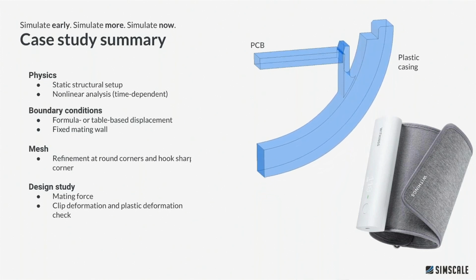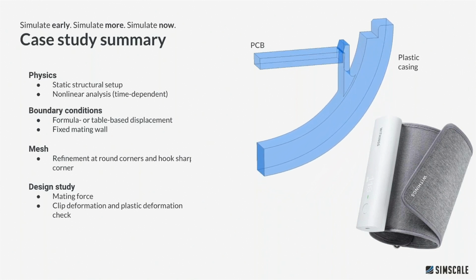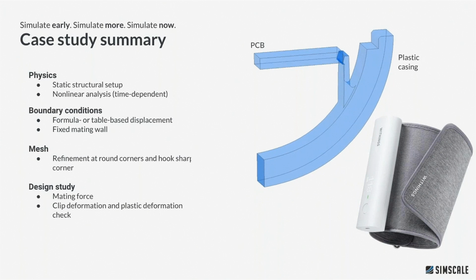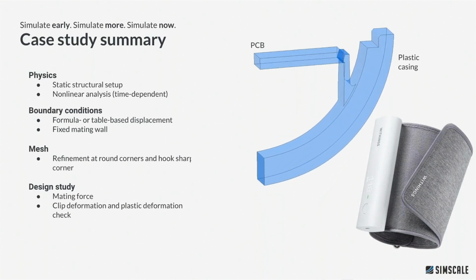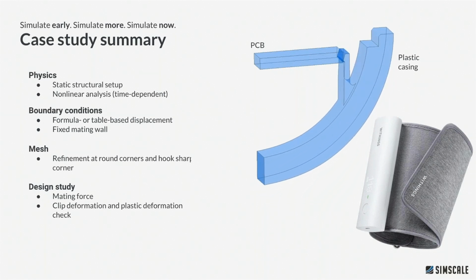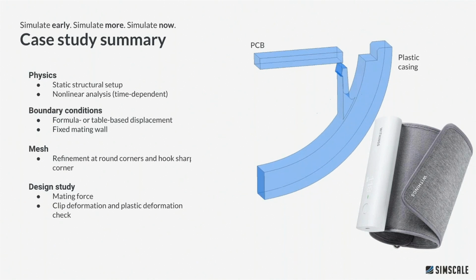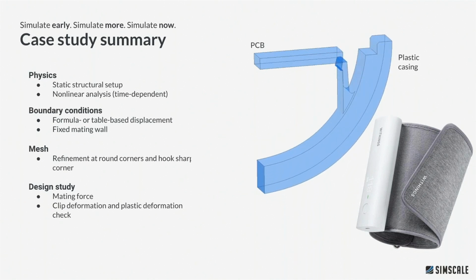The boundary conditions are quite simple, but we need to be rigorous while setting them. So we set a formula-based displacement or maybe a table-based displacement. It depends on the use of the simulation. And also, we are going to fix one of the walls of the PCB because this is the real design. So we need to have an assembly that doesn't move. So we ensure that it doesn't float.